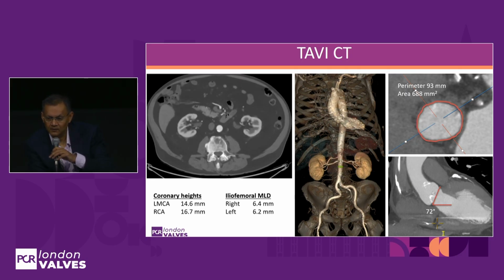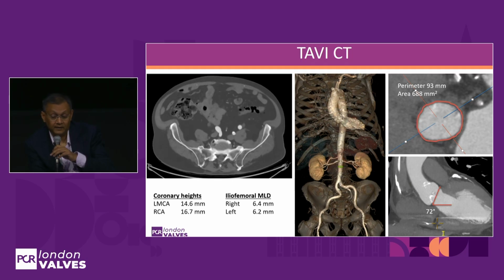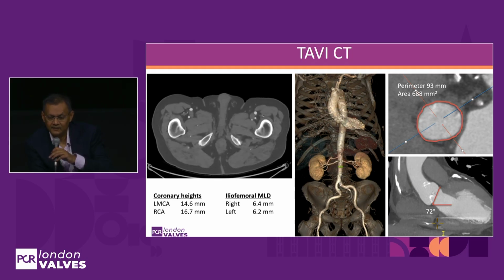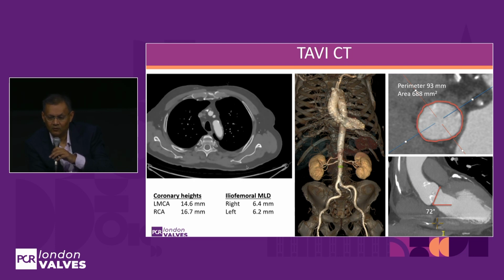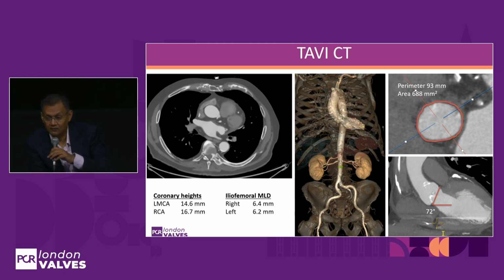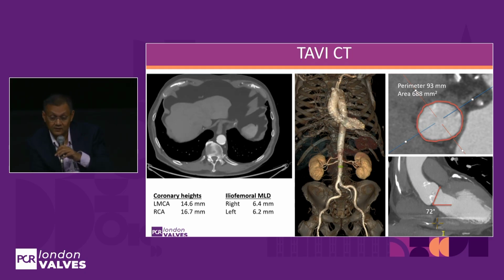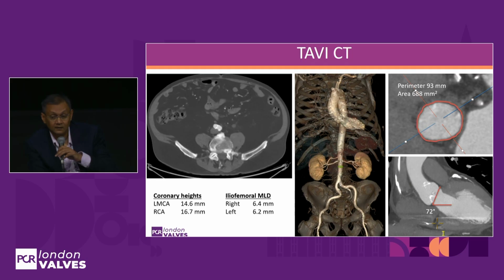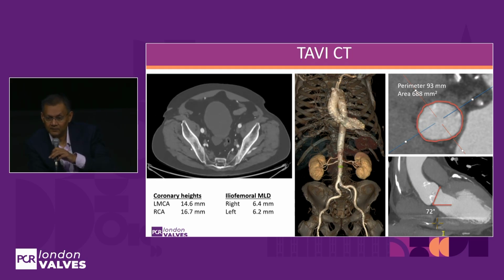With a horizontal aorta, that may be well. The other important thing is that in the context of potential LV dysfunction, you often need very slow, if any, pacing, and the degree of hemodynamic compromise is very limited as well. So I think that would be a pretty good option.